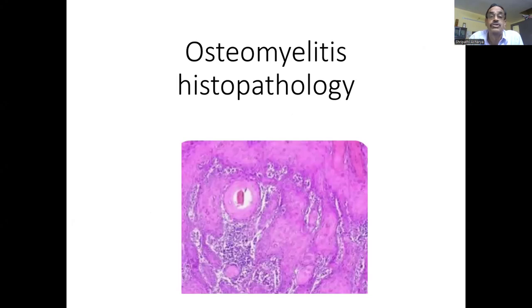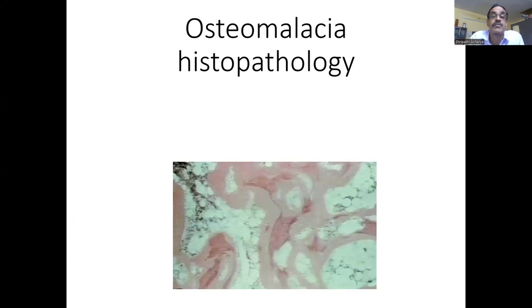Next is osteomyelitis, another slide of osteomyelitis. You can see sequestrum. Next is osteomalacia.